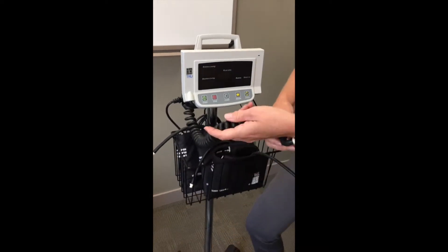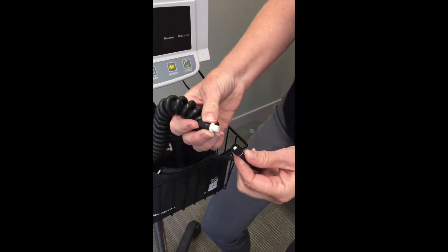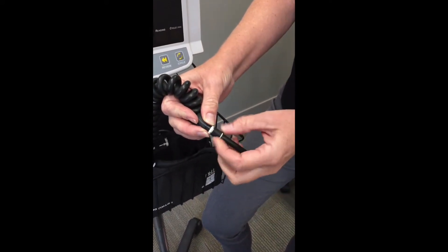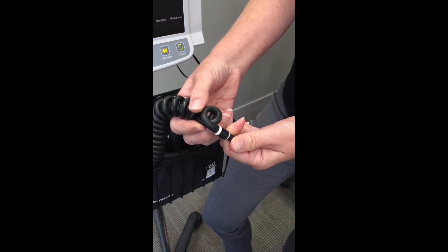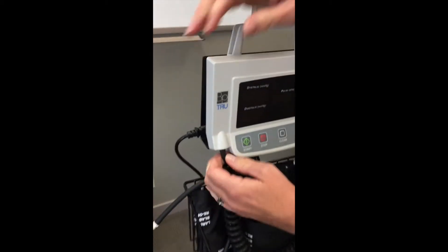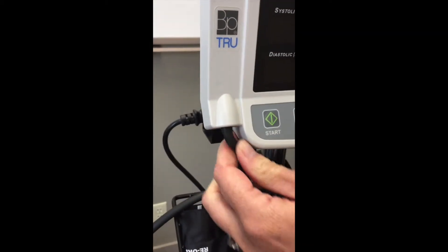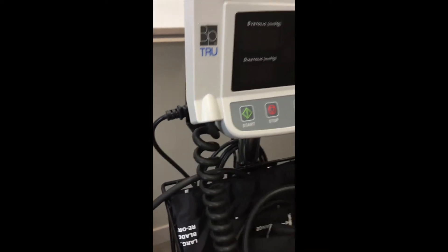The first thing to check is if the cuff is attached correctly to the machine. To do that, just tighten it together, ensure that this is pushed on tight, and also at the top that this is also pushed on very tight to ensure proper airflow.